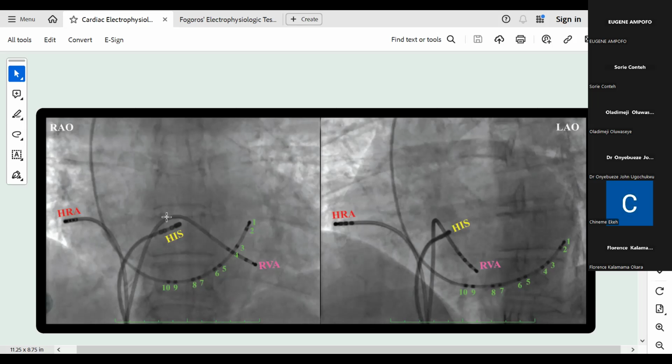So, Dr. Hope, I've been able to answer your question. Great. And you can use both femoral veins. For example, this person's CS catheter is coming from the top, so most likely they used either a subclavian, axillary or jugular vein for this one.